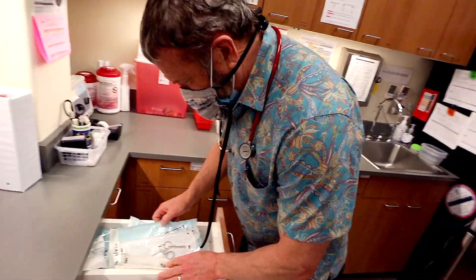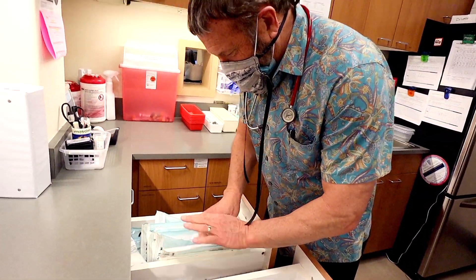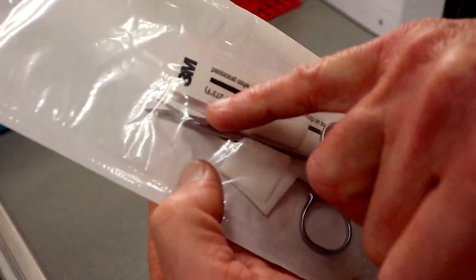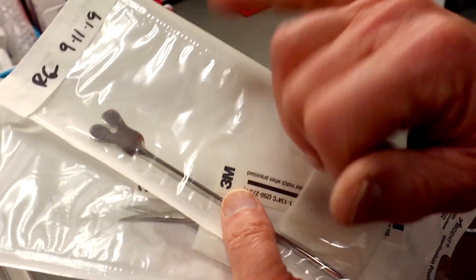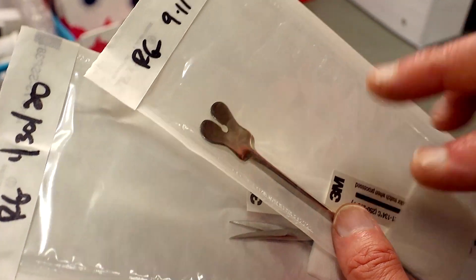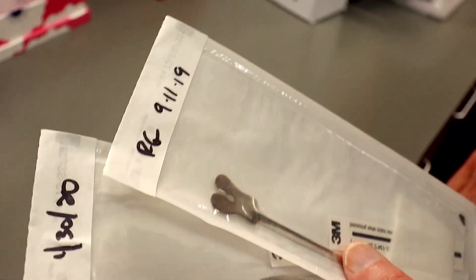We're going to do a tongue-tie clip. These simple ones are easy — that's just a curved scissors and a little tongue depressor. The little membrane I'm going to clip will go right through there. You lift up and snip — you'll see me do that. It takes a split second.